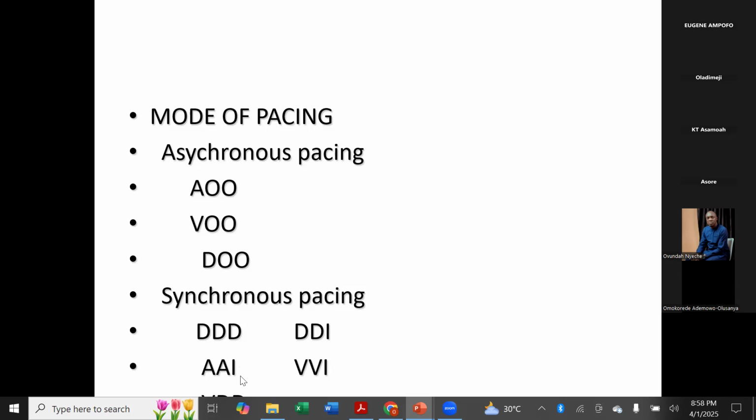The I portion means that when the patient goes into sinus tachycardia, you know, sick sinus, they can go into tachy-brady syndrome. So in the tachy phase, the I component of the AAI will recognize intrinsic activity in the atrium, so it will inhibit pacing. At that time you will not be over-pacing, so as not to generate ventricular tachycardia. Okay? So that's the purpose of the I component of the AAI mode.